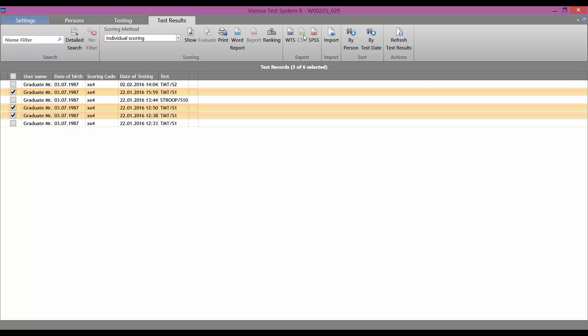We can also export test results into a CSV file. However, we see that the CSV button is inactive. This is because we must first create a CSV export profile.